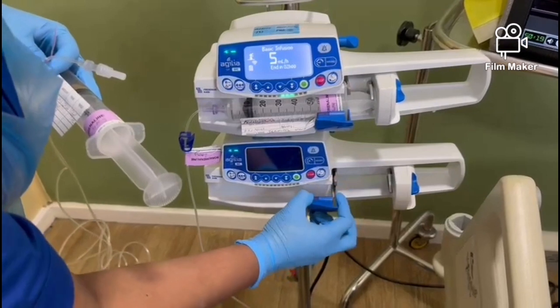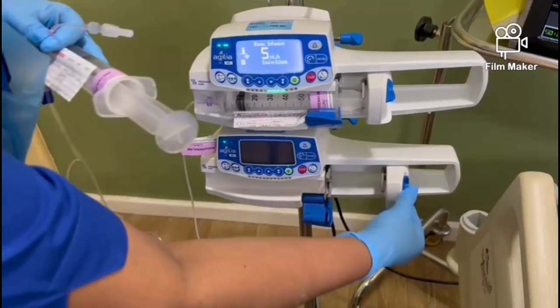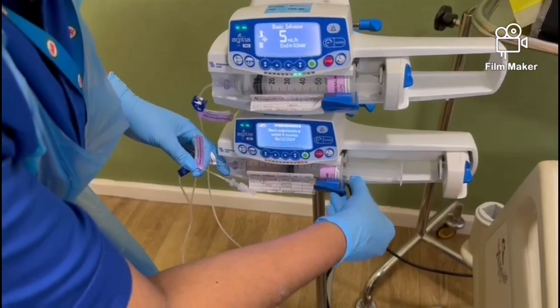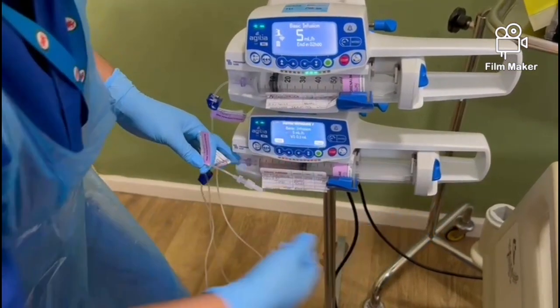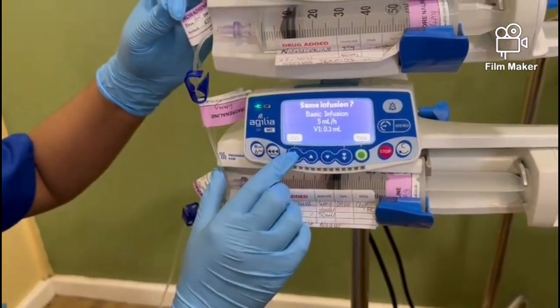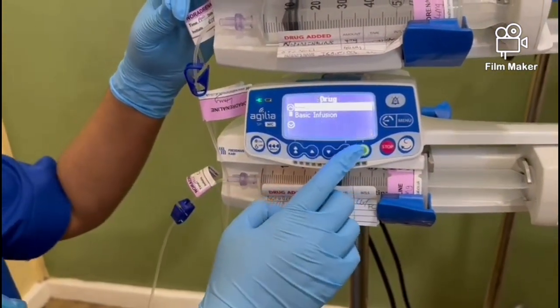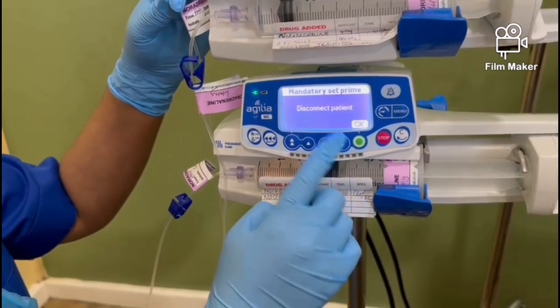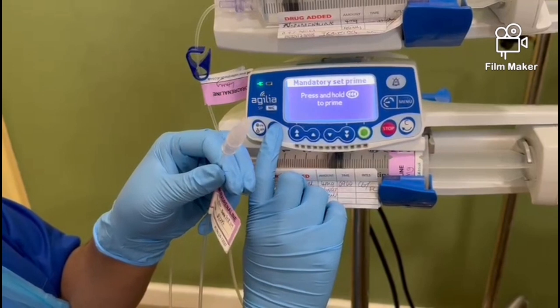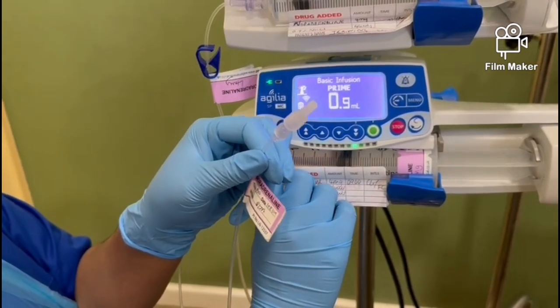syringe as per SOP. We will set our new infusion up in our second designated noradrenaline pump, which should be directly above or below your current infusion. Once inserted into the pump, select New Infusion, and this will give you the option to mandatory set prime. Prime the line until you can see drops coming out of the end of the infusion.